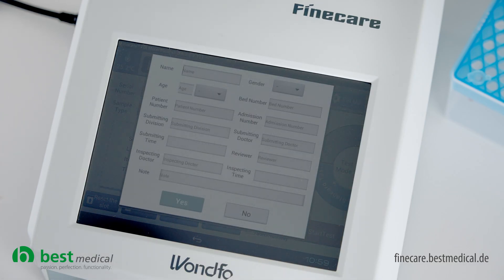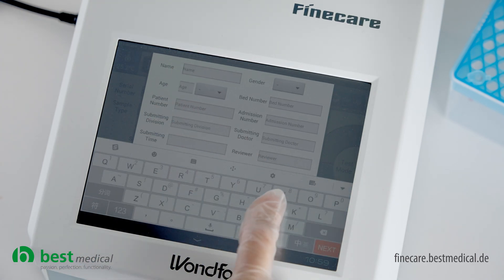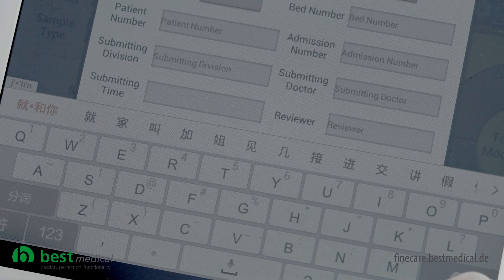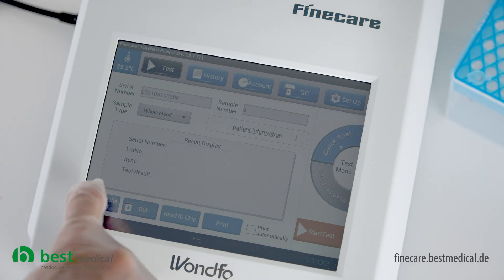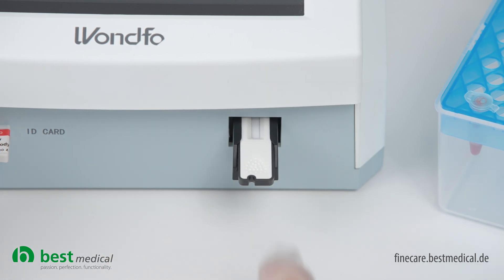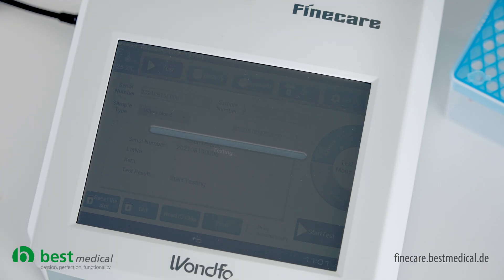Before performing the test, you can still enter patient information via the touch screen. To perform the standard test, you must first extend the carriage. Now insert the test cassette with the arrow pointing forwards as far as it will go. Press the start test key to start the standard test, which evaluates the sample directly in the instrument.